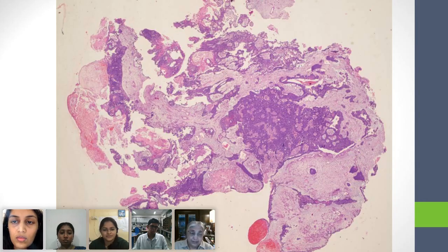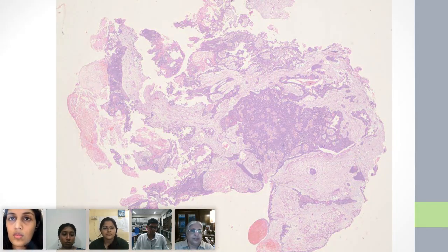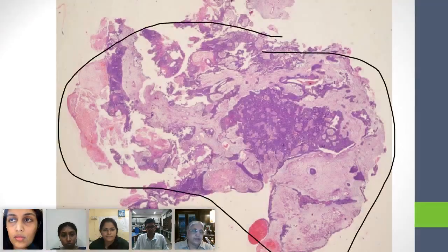No. So that's something that should put your antennae up. I am seeing over here, and maybe if I can see this, look at this whole piece of tissue. Yeah, and this is what had popped out through that hole. Is it very likely that it will be covered with some normal mucosa? No. Very unlikely, right? So we should be on our guard.